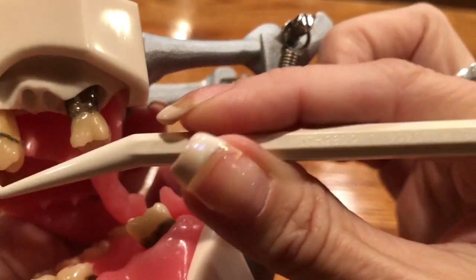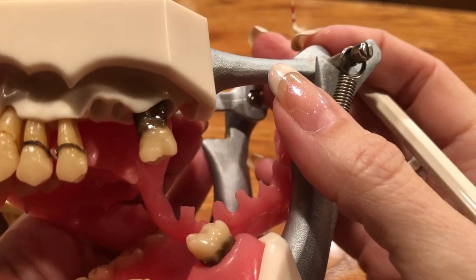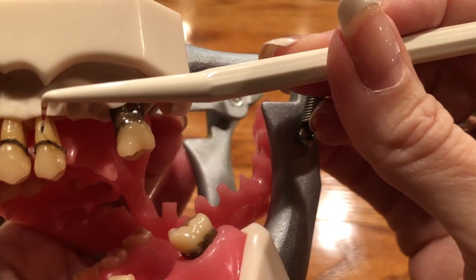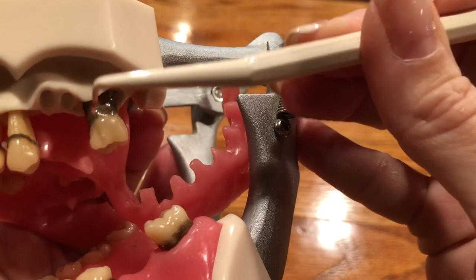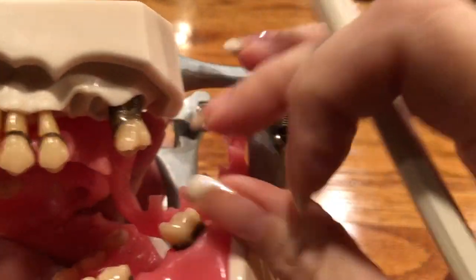When you've got this much tartar, this is when your dental team or your hygienist is talking about doing what's called a deep scaling. And you usually are going to need to be numbed up because we're going to have to go down below the gum line and scrape this off. And we do it by feel. We can't see it.